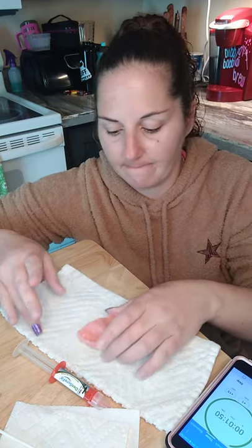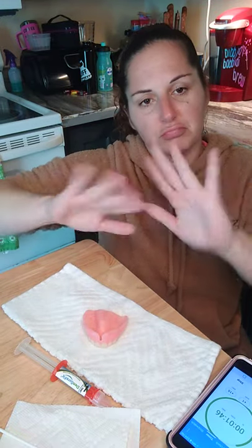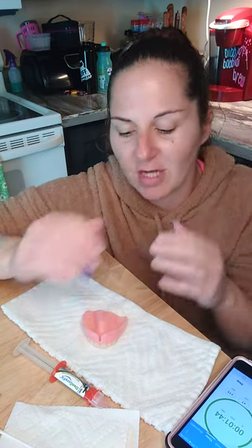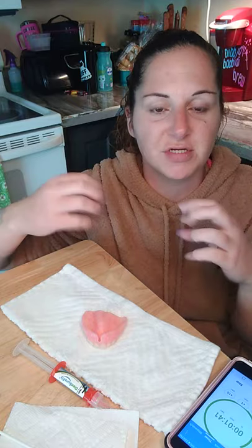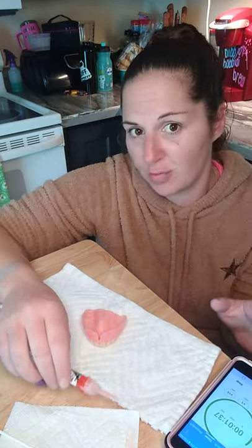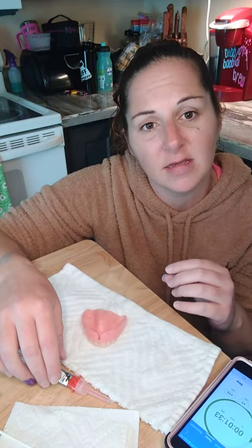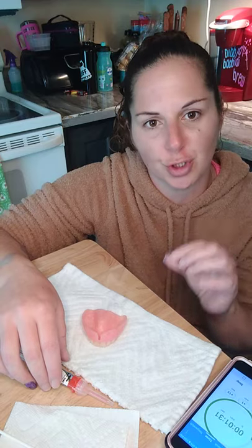Just let this dry. Let it dry, let it do its thing, and let it heal out. If you guys don't get every spot of this, it's not going to fully stick. So you want to make sure you do that. Our next step, which obviously I'm not going to do right now, is when you twist this and you apply. And I'm going to show you exactly how to apply it, because there is a certain way.